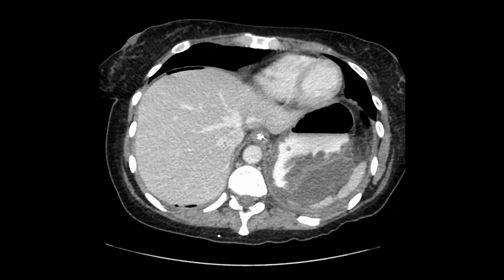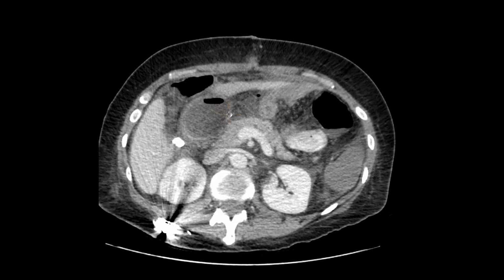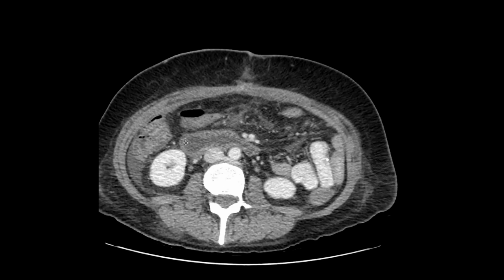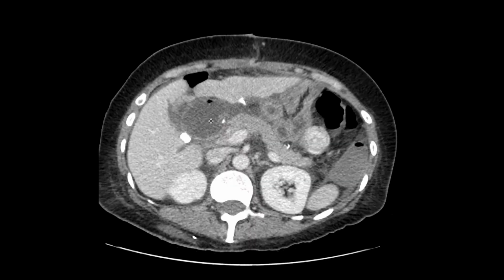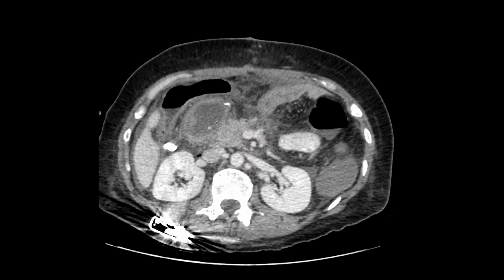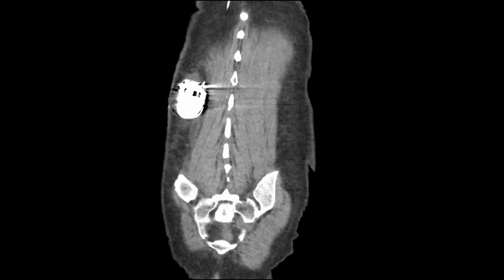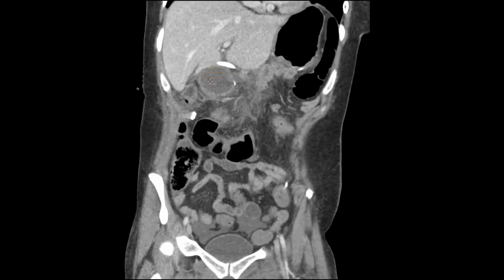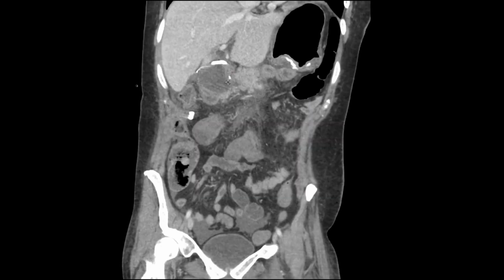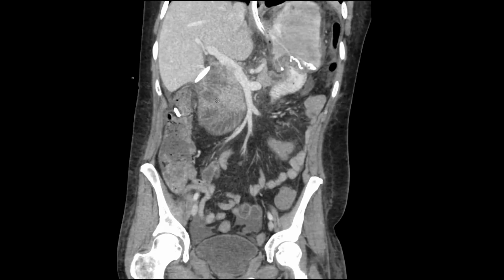Okay? We also had a chance to tell him that that piece of duodenum that you oversewed over here, that is still left connected up to the common duct and the pancreatic duct? Well, it's pretty damn dilated, okay? And I don't want that suture to blow out. And why is it dilated? Well, we found a stricture. Okay, let's go back to the coronal. Here's our coronal. Here's our dilated piece of duodenum that's oversewed over here. Here's the suture line. Follow that down. Boom. There is a narrowing right there, and that's why this piece is dilated.